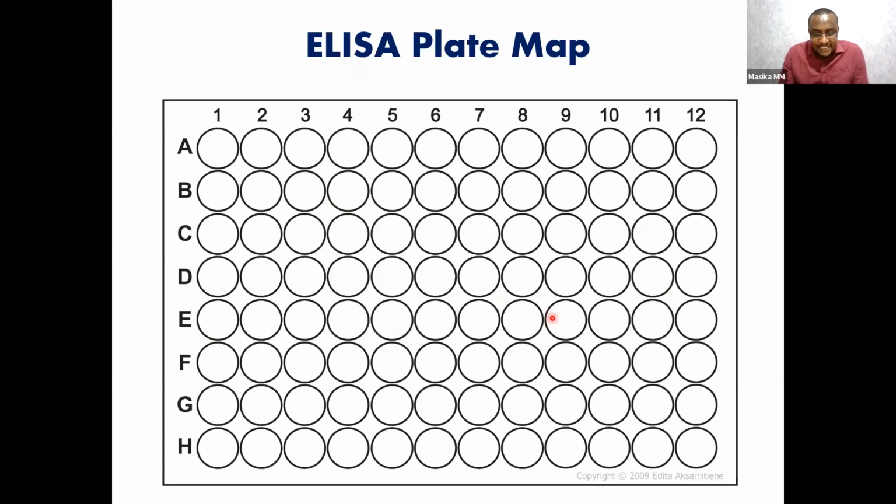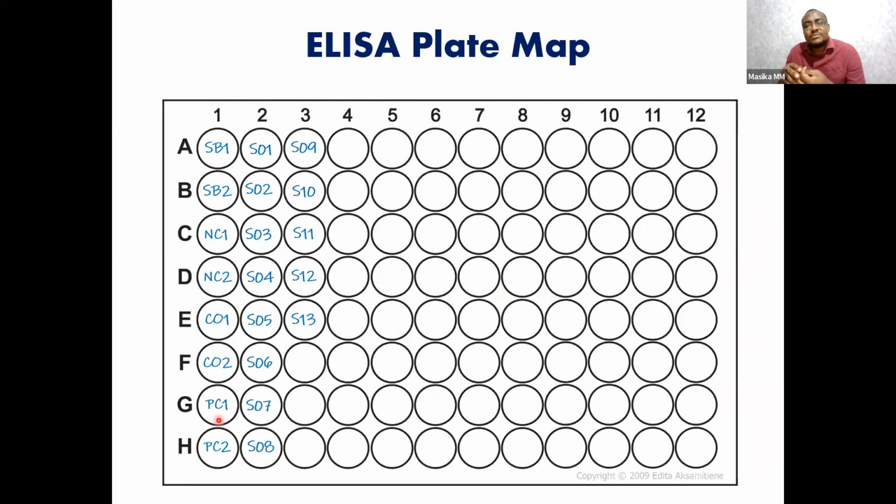Depending on the assay, you might find that it requires standards, negative controls, duplicates, a positive control, and you can also have your own control sample. For example, somebody gave me a sample because they had antibodies for Zika. I have antibodies, say, for yellow fever, because I got vaccinated twice. I know I have antibodies that have been confirmed with a cross-reaction. So I want to see, will this kit detect them? Because I already have this sample that I know, you can include it there as a control.